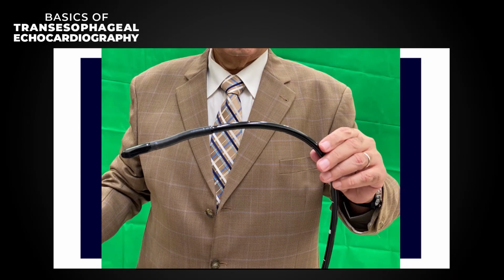We see a lot of patients in middle age, in their 30s, 35, presenting, previously completely healthy, with a stroke of unknown source. So for those young adults who are not usually atherosclerotic, you have to check for a PFO. You have to prepare your agitated saline and look for a PFO using a transesophageal echo.